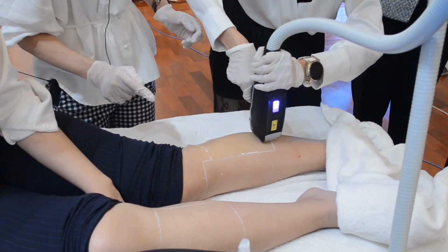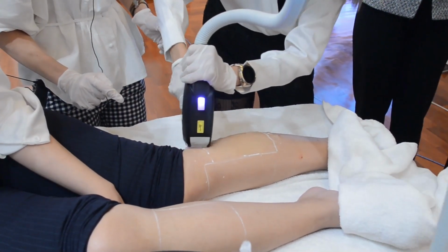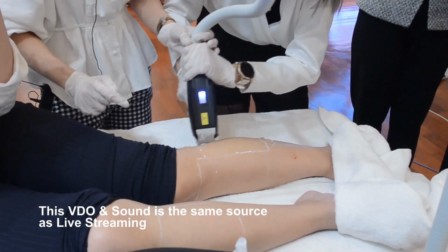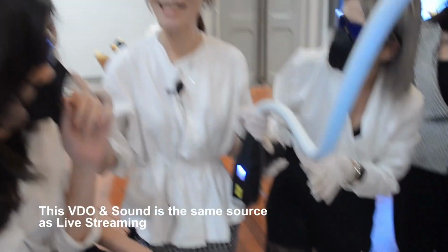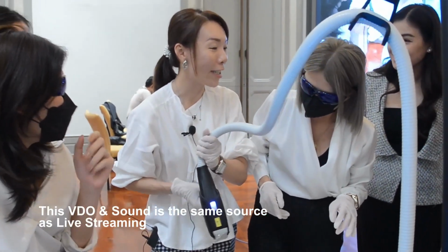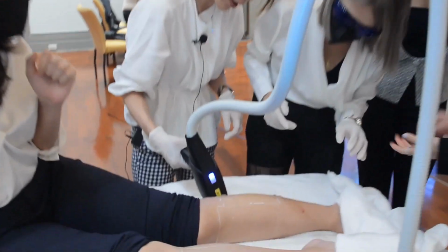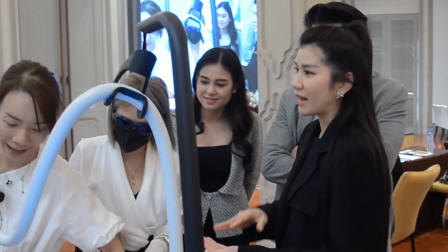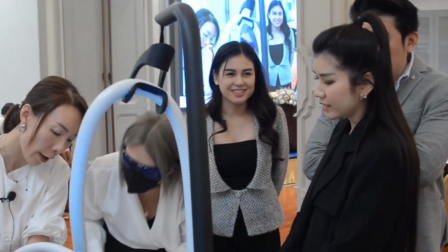Yes. Just keep continuing. Stop. Okay. It floated. You know why? Because there was no full contact. So when you were going down, this thing went this way. So at all times you have to have full contact. At all times you have to have full contact.